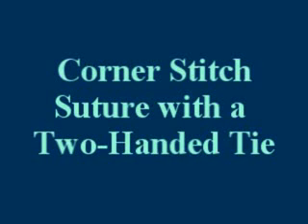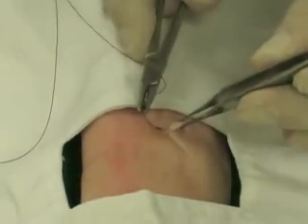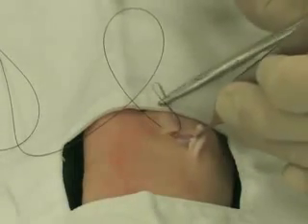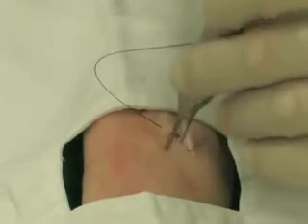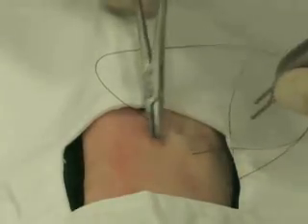Now we will demonstrate a corner stitch with a two-handed tie. With the corner stitch, imagine a plumb line through the middle of a flap. The first suture starts above the apex and is parallel to the plumb line. Then lift the flap, and from one side of the plumb line to the other, place a subcutaneous suture. Finally, in the other direction, place another suture parallel to the plumb line that comes out parallel to where the first suture went in.